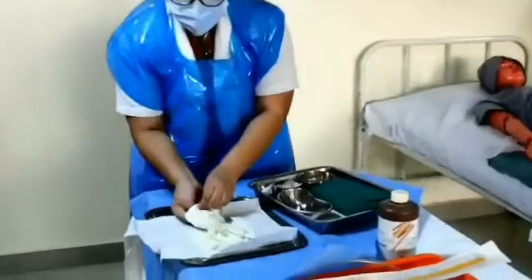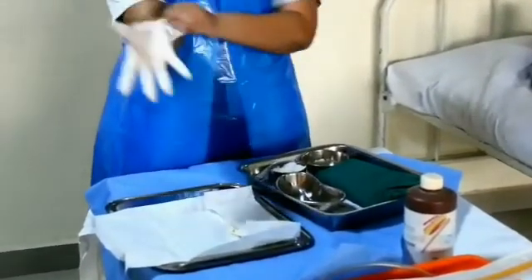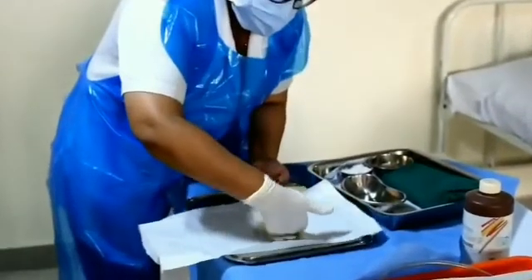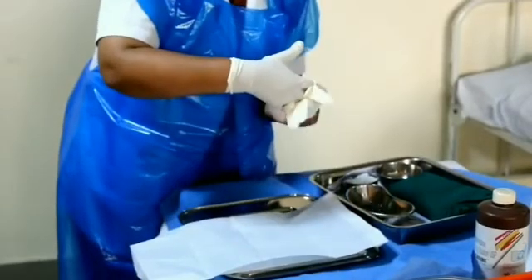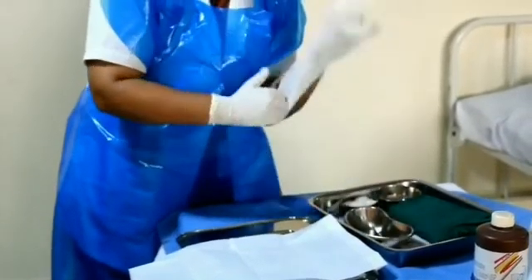First, wear the glove on the dominant hand by sliding the fingers down. With the gloved hand, touch the inner aspect of the cuff. Slide down the fingers of the non-dominant hand. Then the gloves can be adjusted.